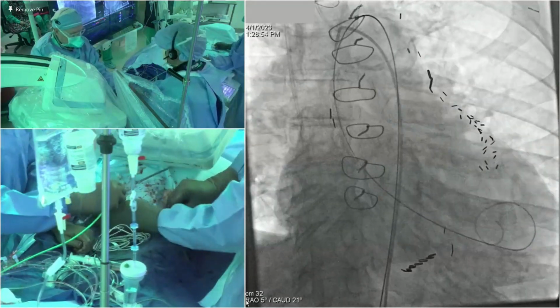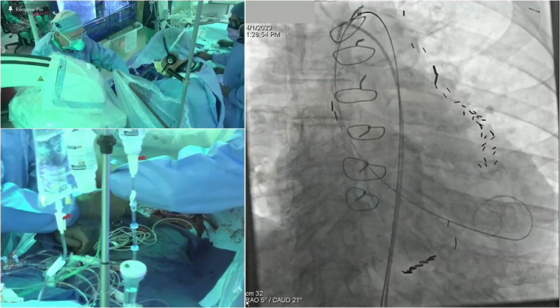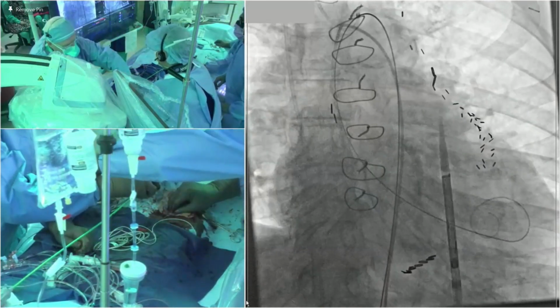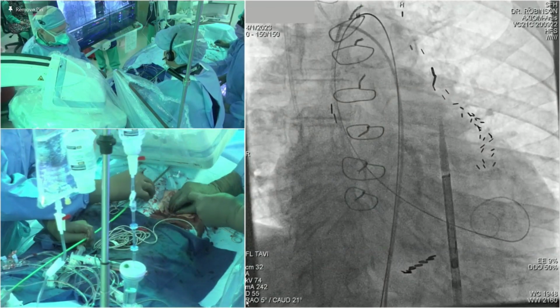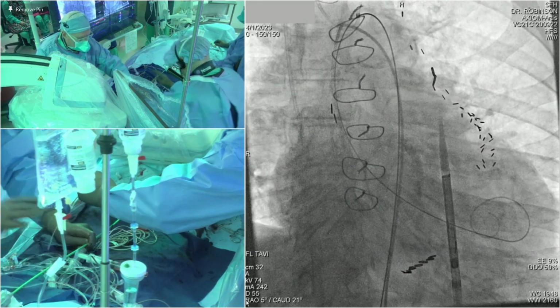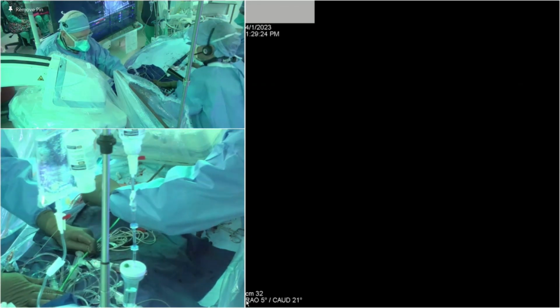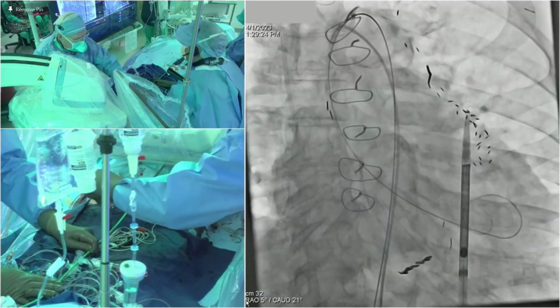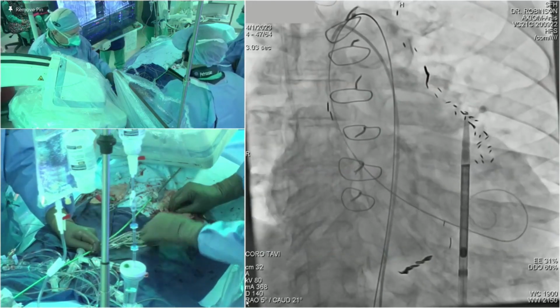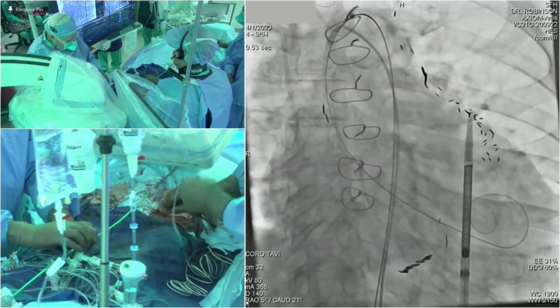So in answer to your question, while George is showing you the safety check, what we're looking for here is we want to make sure that the valve is smoothly loaded and that there's no infolding of tissue. This looks great, so you don't see anything. You don't want it to go past the third node. Third or fourth, yep.